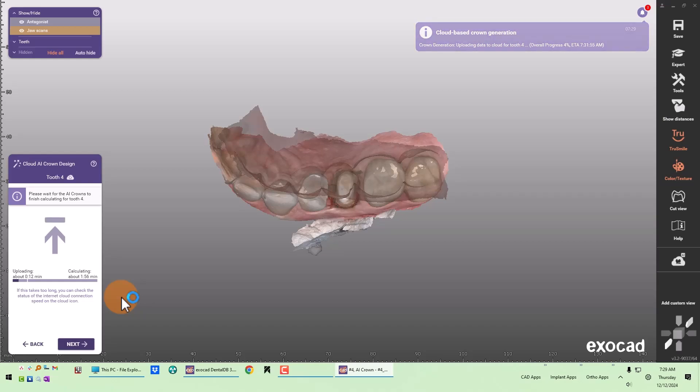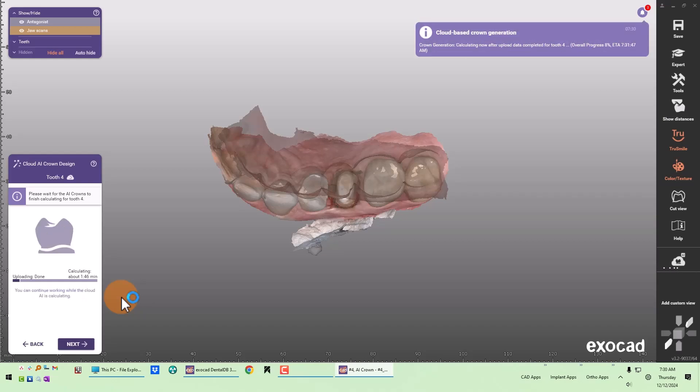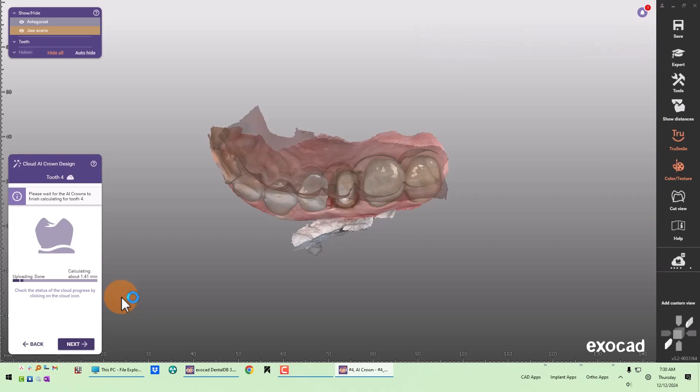You can see it takes about 20 seconds to upload, and then once it's uploaded it's less than two minutes to design the crown. You could be doing something else while you wait.